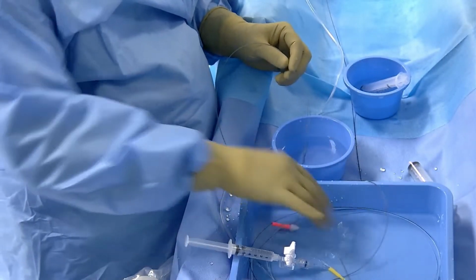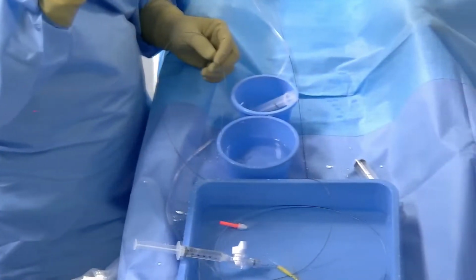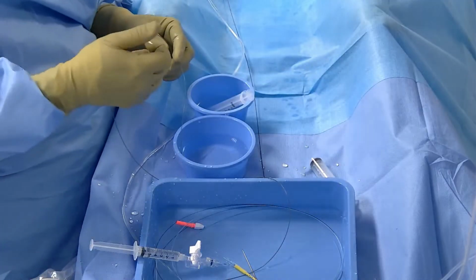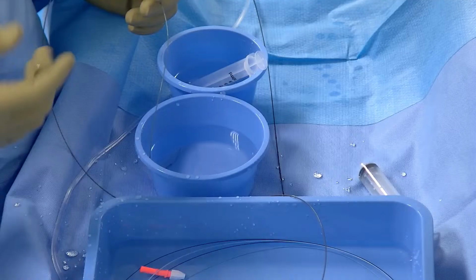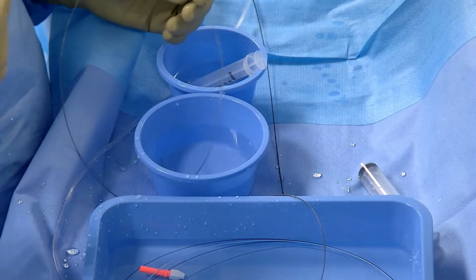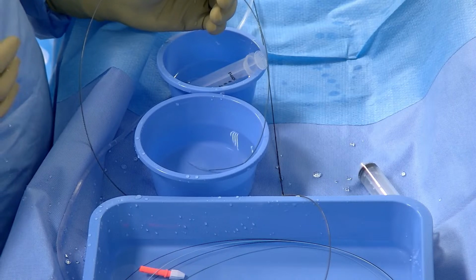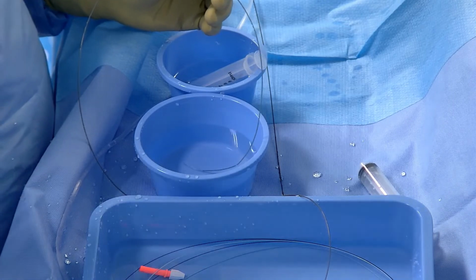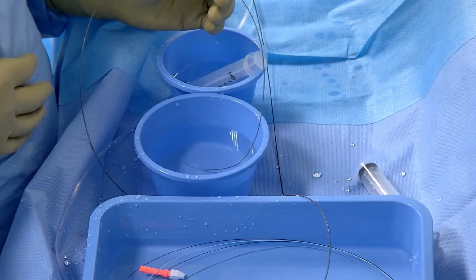The tip of the balloon should be inside the water or contrast, because there is a small hole, and if you just take it outside of the water and deflate the balloon, it may aspirate some air, and during the inflation, the balloon could be non-properly prepared.